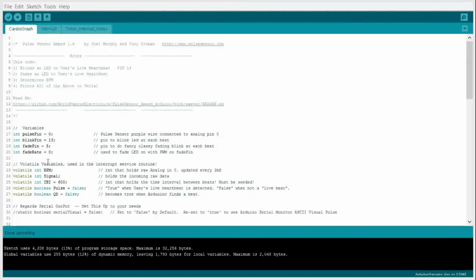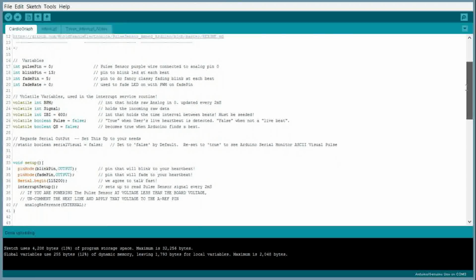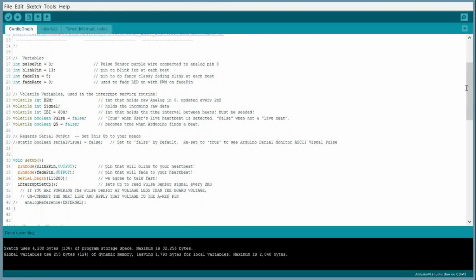In fact, I had all of this set up, the LED blinking and fading, but I took it all apart because I felt like the increased light, every time you get a pulse you get all this light from the LEDs, was actually affecting the pulse sensor's light readings, because it's basically using photoresistance to detect your pulse. So if you have all sorts of lights flashing, that could cause all sorts of noise. So I turned that off.